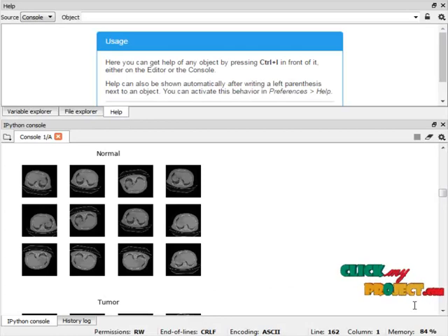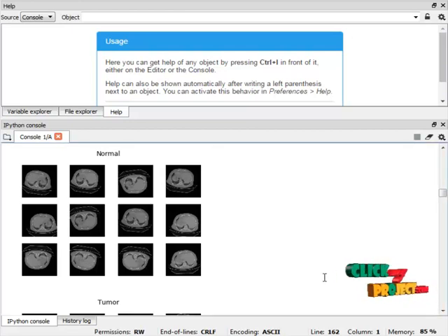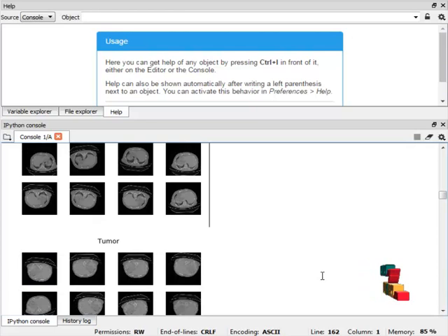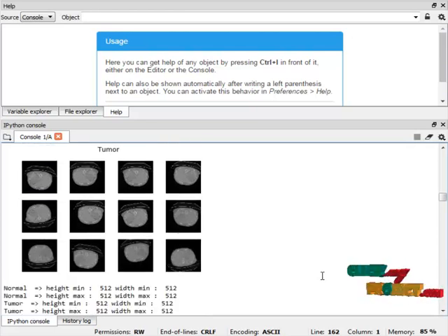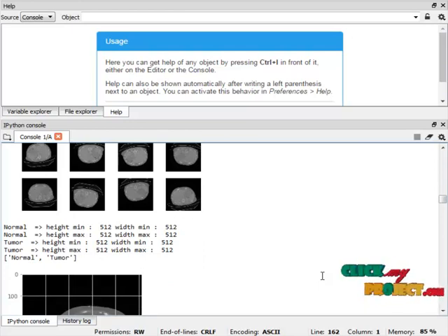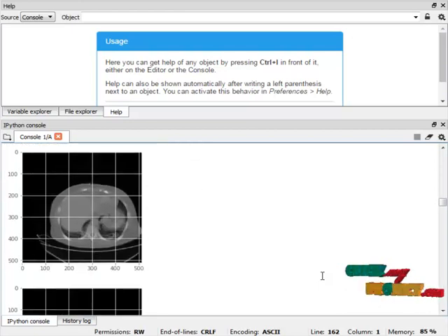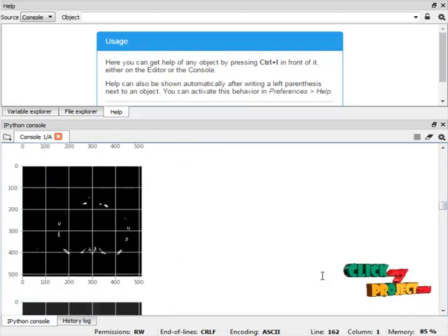The program was successfully run in Anaconda Navigator with the Spyder IDE. In the first module — the data selection and loading module — sample images of normal and tumour liver CT scans are loaded. The system checks the minimum and maximum height and width dimensions for every image in both the normal and liver tumour categories.